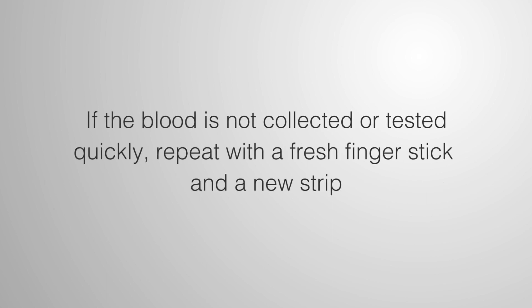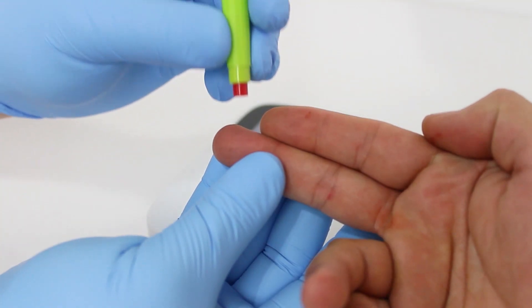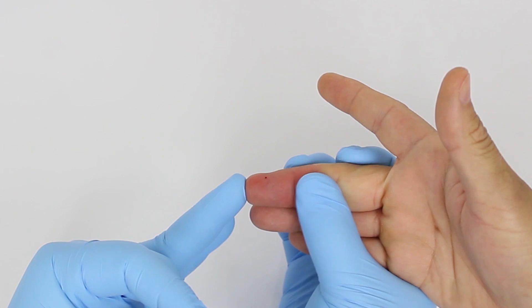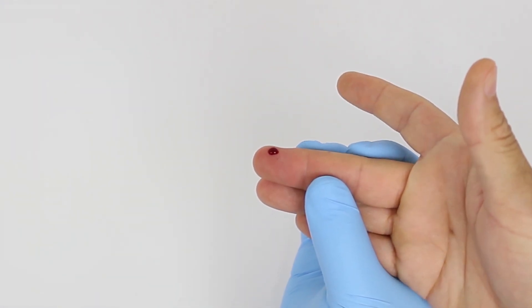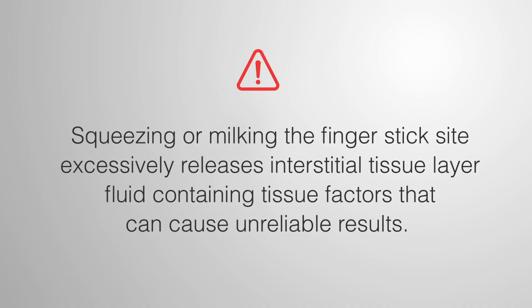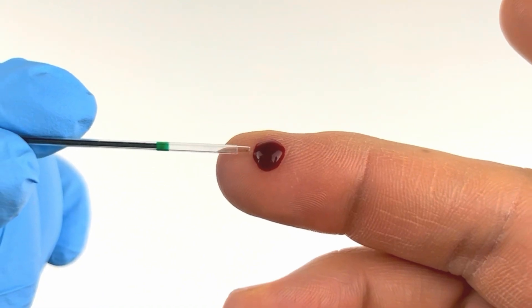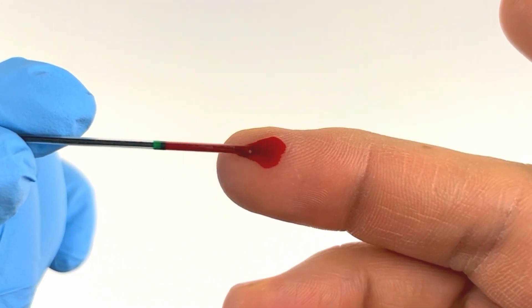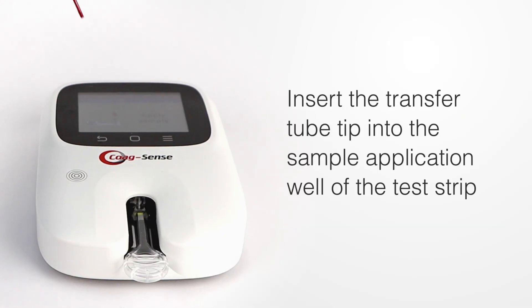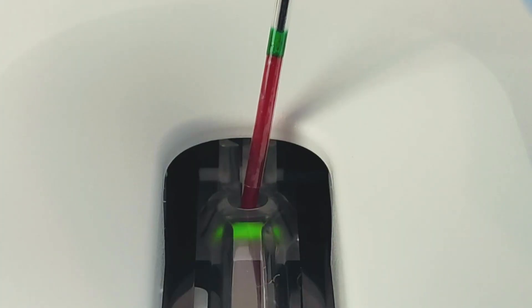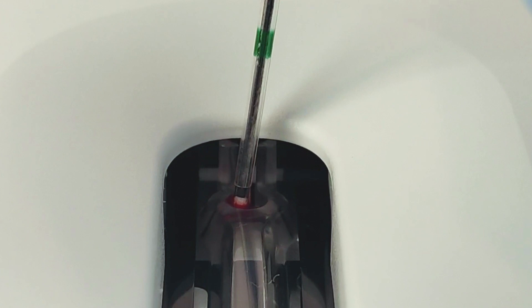If the blood is not collected or tested quickly, repeat with a fresh finger stick and a new strip. Use only 21-gauge lancets, as smaller diabetes lancets do not produce sufficient whole blood volume. Just a 10 to 12 microliters drop of blood sample is required. Squeezing or milking the finger stick site excessively releases interstitial tissue fluid containing tissue factors that can cause unreliable results. Collect the sample using a sample transfer tube, holding it horizontal; touch the tip to the bead of blood and let capillary action fill until blood flow stops at the green band. Insert the transfer tube tip into the sample application well of the test strip, touching the tip down at the flashing green light in front of the spinning wheel, then push the plunger down to dispense the sample fully.